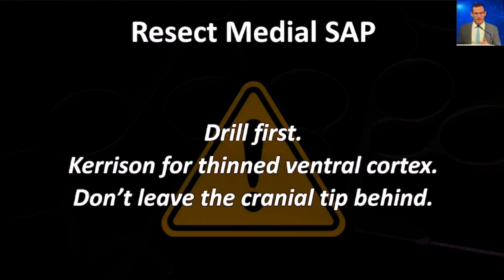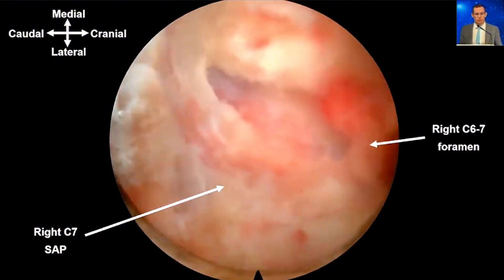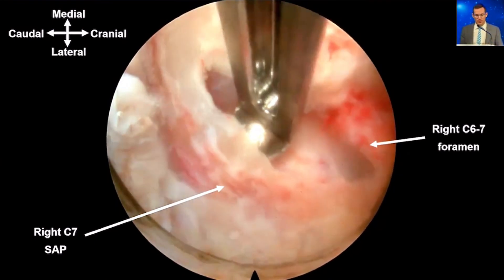Then you resect the medial SAP. I drill first, but remember the nerve is directly underneath that bone, so I really thin it out — it's almost clear, like ice sometimes. Then I use the smallest Kerrison to remove just that last layer of bone over the nerve. It's important not to leave any of the cranial tip of the SAP behind, because that can be a source of residual foraminal stenosis and potential symptoms. Here I'm removing that last wafer of bone with a Kerrison punch, and underneath it you can see the neural elements.